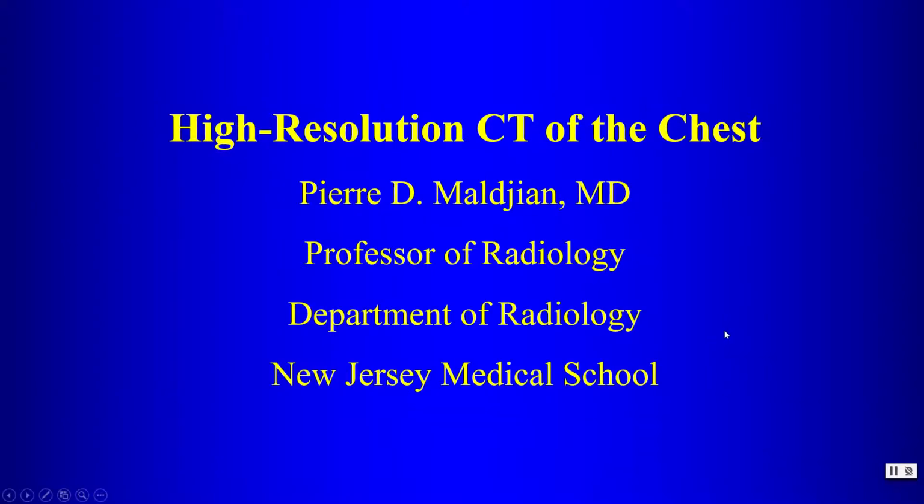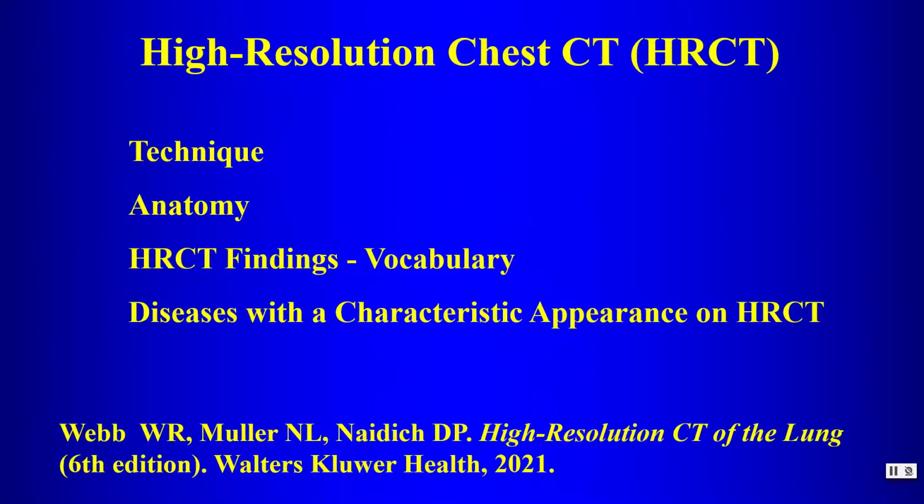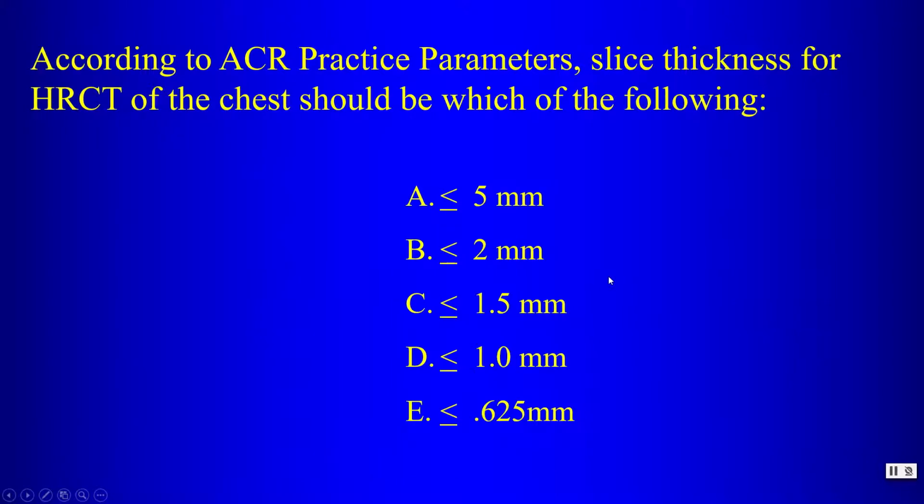Okay, so today we're going to talk about high resolution CT of the chest, and much of this will be review of material that we've covered before, so we're going to move rather quickly. We will talk about the technique, the anatomy, and mostly about the vocabulary of high resolution CT findings, and then diseases that have a characteristic appearance on high resolution CT that we want you to be able to recognize.